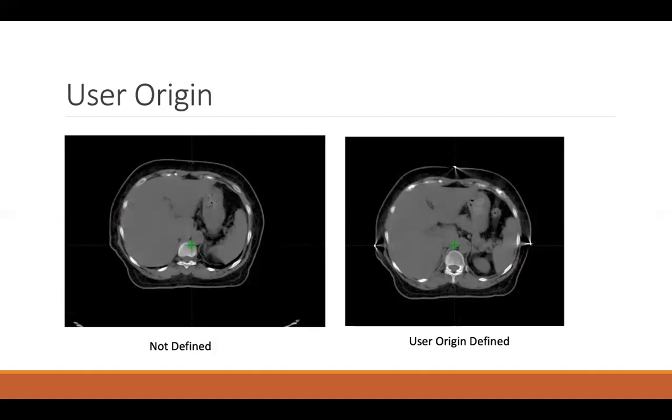Till now, many centers don't have image guidance. So if you don't have image guidance and the user origin is not defined properly, then it is very difficult to treat with appropriate position. So the user origin should be defined.